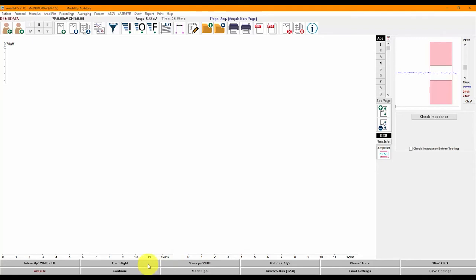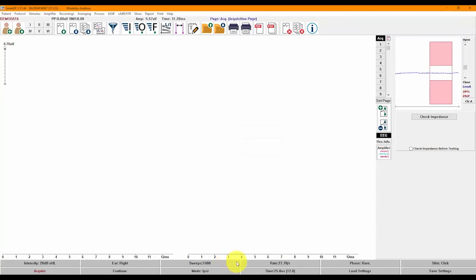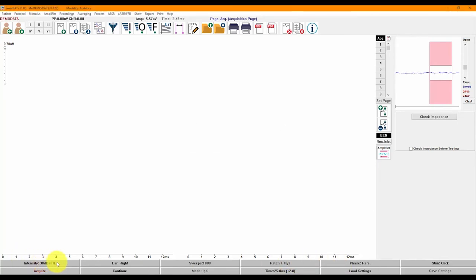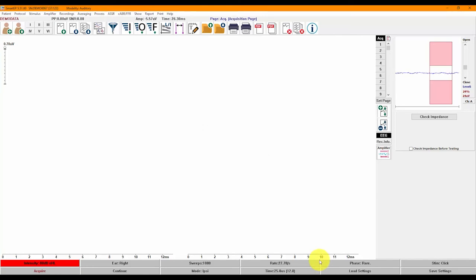You can easily modify any parameter right from the control panel without needing to go into submenus. For parameters with set options, simply click on the item to toggle through the available options. With a single click on the Ear button, you can change from left to right or both ears. You can switch polarity with a single click — going from rarefaction to condensation or alternating. For other parameters, you can double-click to enter specific values. To change the number of sweeps, double-click and enter a value. A right-click on Intensity will increase it by 10, and a left-click brings it down by 10, or by the selected step size.